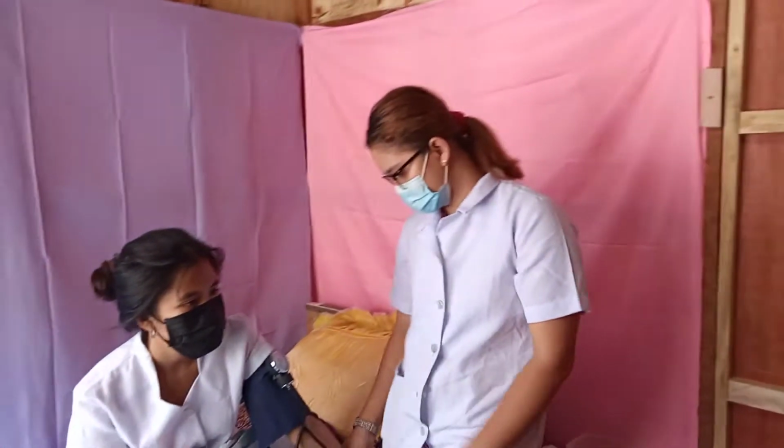After that, estimate the systolic pressure. Palpate the pulse of the brachial artery. Inflate the cuff and note the reading when the brachial pulse disappears, then deflate the cuff. Rationale: to prevent underestimation of the systolic pressure or overestimation of the diastolic pressure.